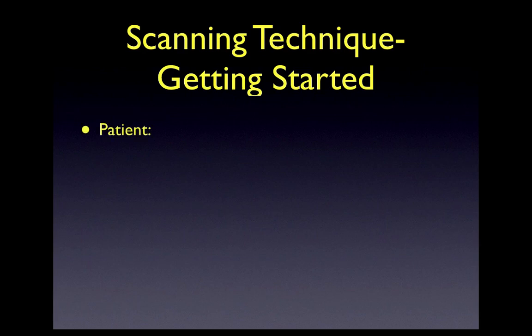So let's talk about scanning technique. With regards to patient position, the majority of the literature that describes the position of the patient describes the patient as being in the supine position. Now, as you can imagine, if you have a patient coming into the emergency department with acute decompensated heart failure, you're not going to be rushing to lie them flat because they may decompensate even further. Thankfully, there is some literature in which the patients were also evaluated in a semi-recumbent position, and there are even a couple abstracts in which the same patients were evaluated in both semi-recumbent and supine, and there was no significant difference between the metrics.